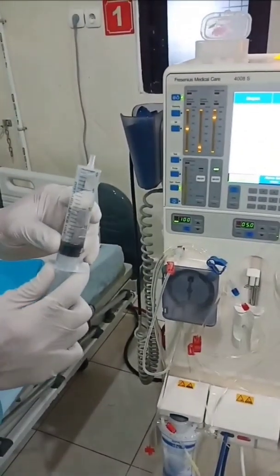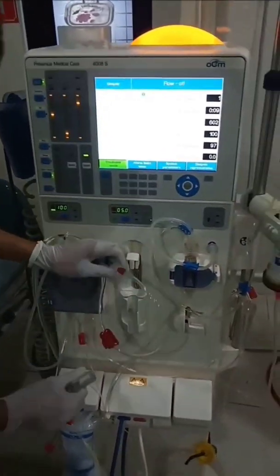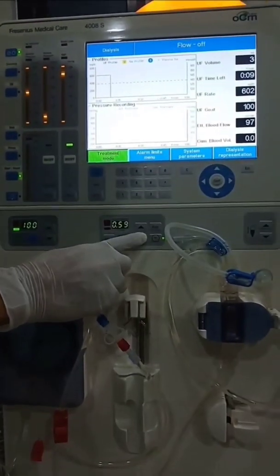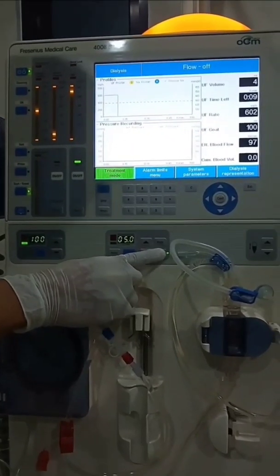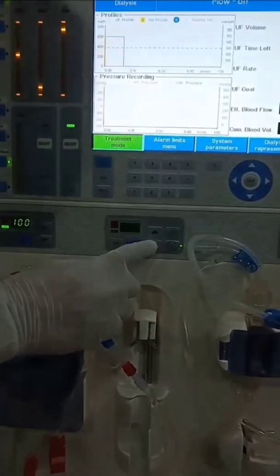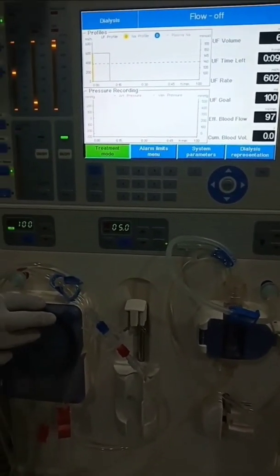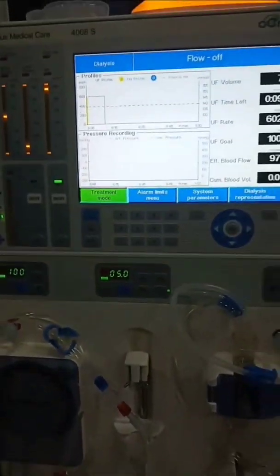Start dialysis. Prepare a 20 cc syringe filled with 0.9% NaCl and heparin according to the patient's dose. Determine the heparin program. We recommend setting the heparin program before the dialysis program starts by pressing the clock image button, then select the arrow upper or lower for the heparin 1.0 program, meaning heparin will stop 1 hour before HD stops. Press the image again.